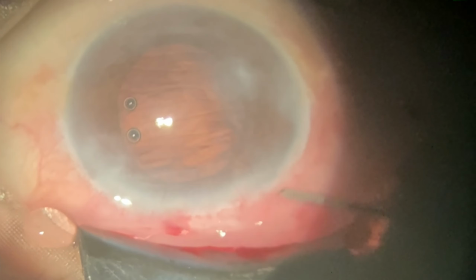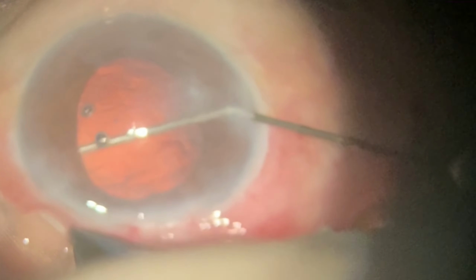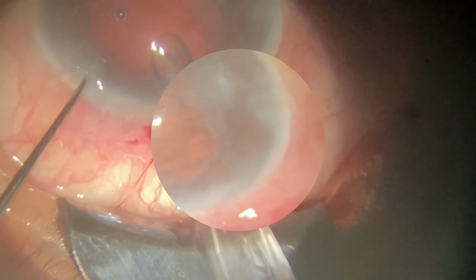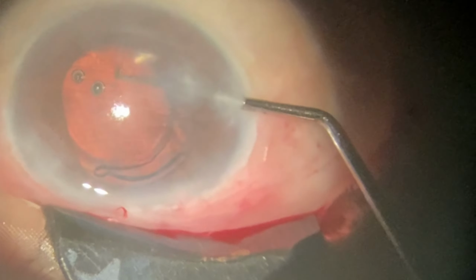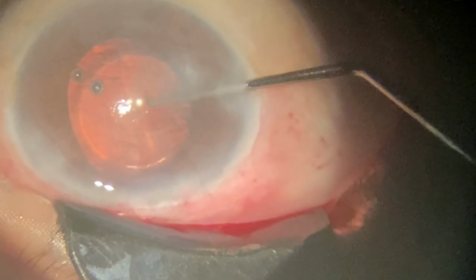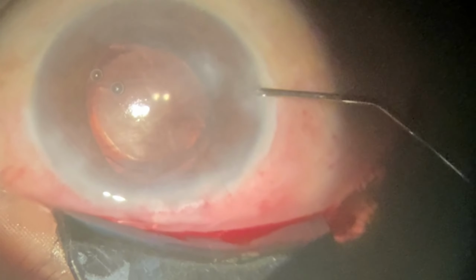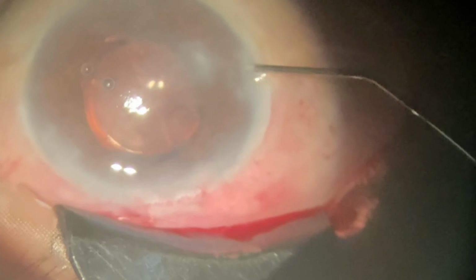I am ready to implant a foldable intraocular lens through the 2.8 main incision. Placing the foldable intraocular lens into the sulcus, I am rotating it and then I am using intracameral pilocarpine to constrict the pupil.